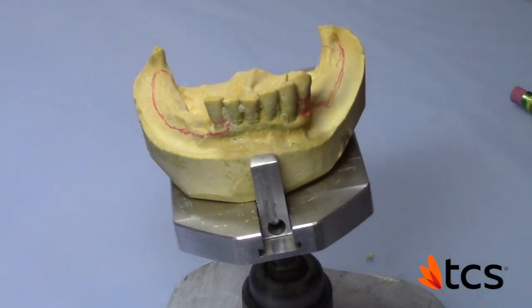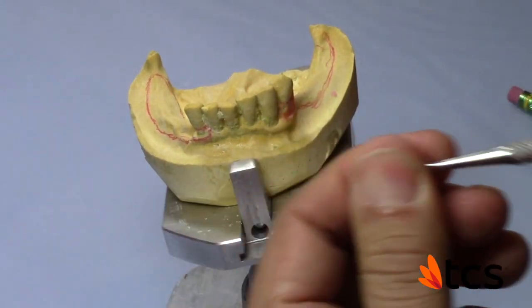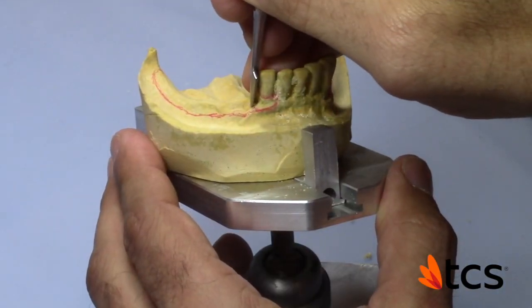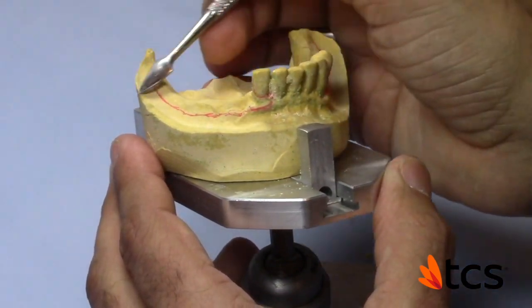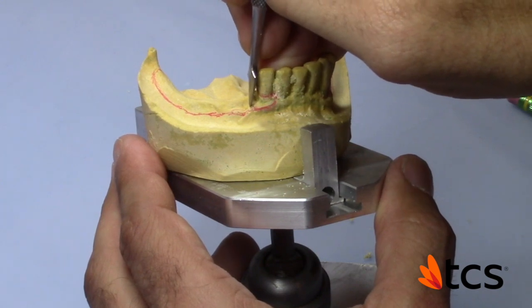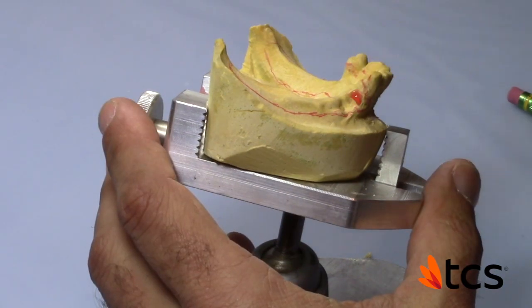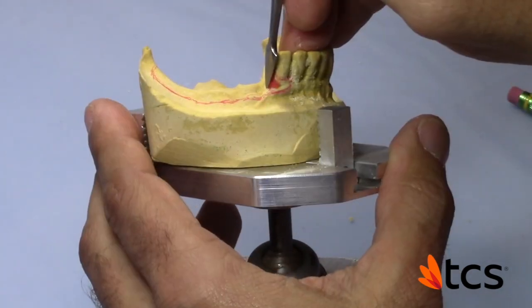It actually looks straighter now — not a hundred percent straight, but straighter than it was, which will give a little less finishing time. I'm going to leave it alone; it's not horrible. I'm really concerned with the extension here, so let me show you what it should look like if you really want to block it out.